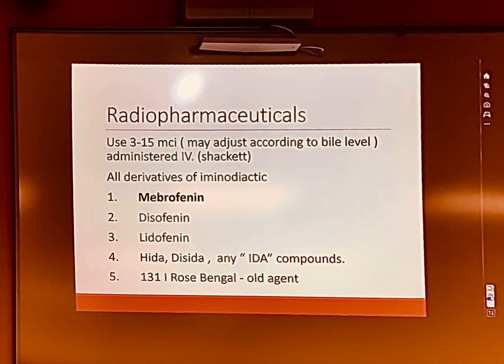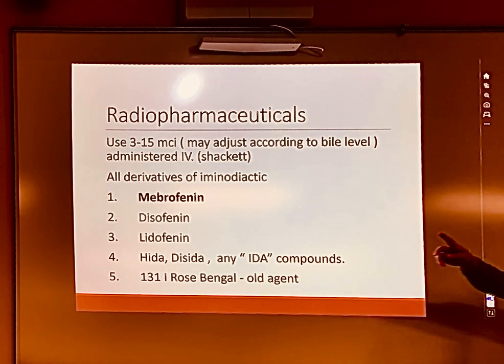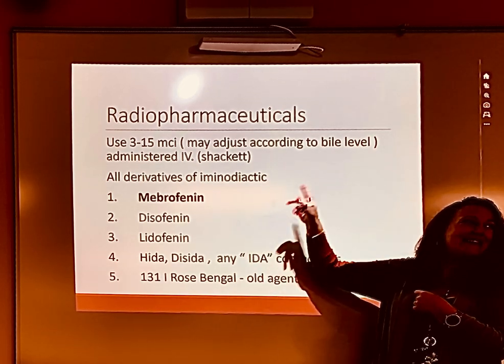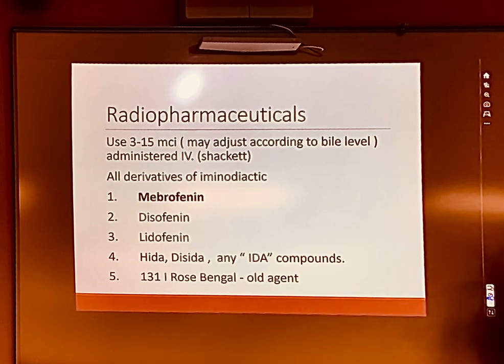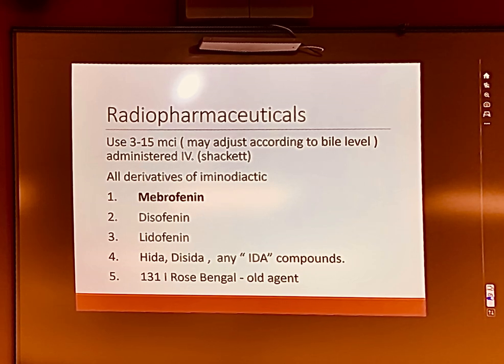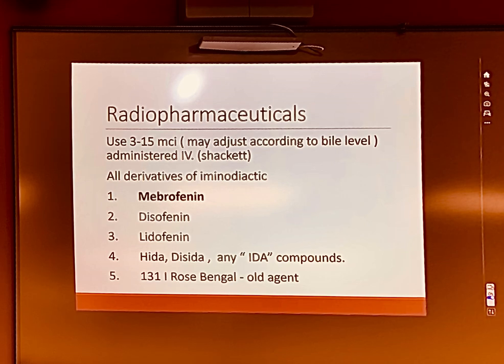Okay, IDA because it's iminodiacetic acid, right? So it's IDA. That's why they call them IDA compounds. Okay? Depending on how old your doctor is that you're working with, sometimes they'll say they want a DISIDA scan, they want a HIDA scan, they want a gallbladder study. Like, there's just a million names that they call it. But the most common is HIDA.